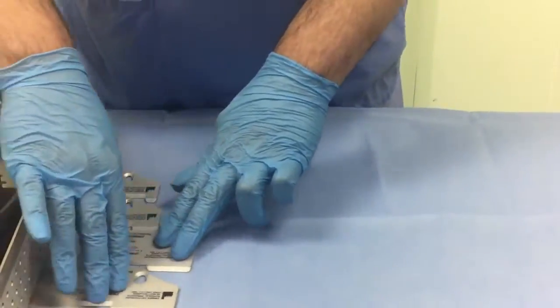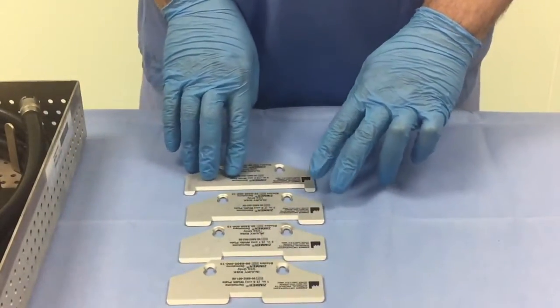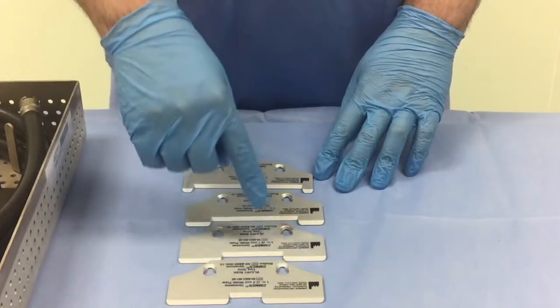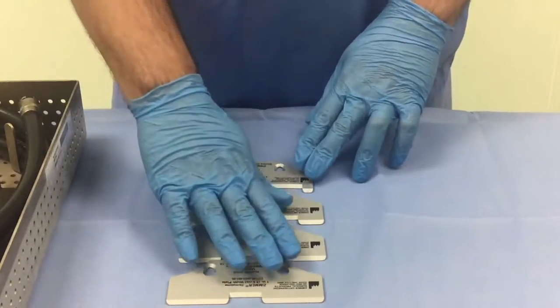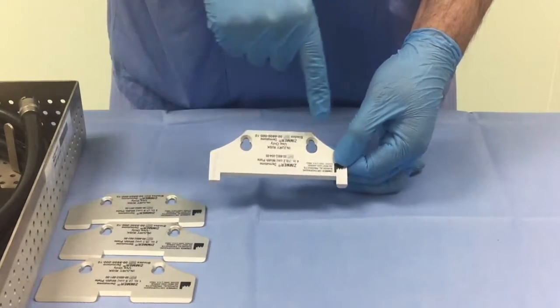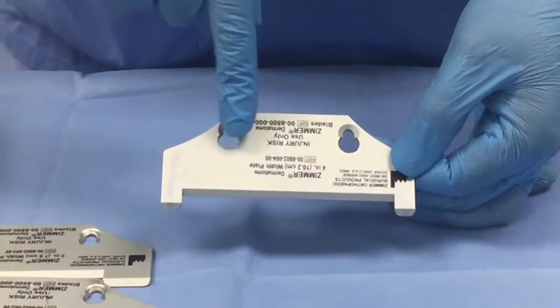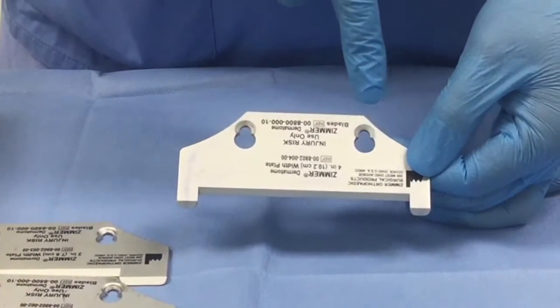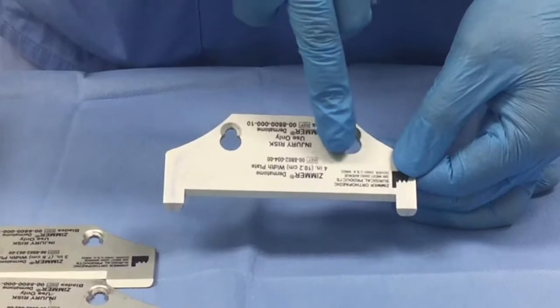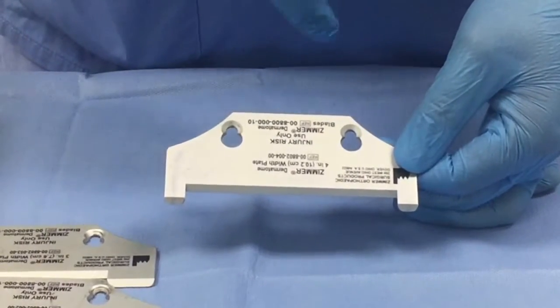As far as the base plates are concerned, they come in various sizes depending on the width of the skin graft that you need to take, ranging from 1 inch to 4 inch. The base plate itself has got two holes for the screws to secure to the base of the dermatome. It has got a wider section to slide through the screws and a narrow section to secure the plate itself.